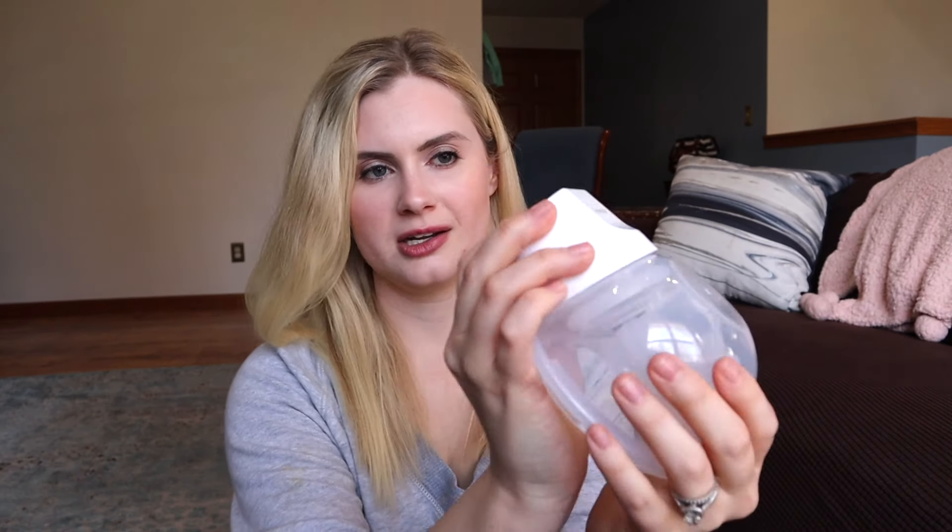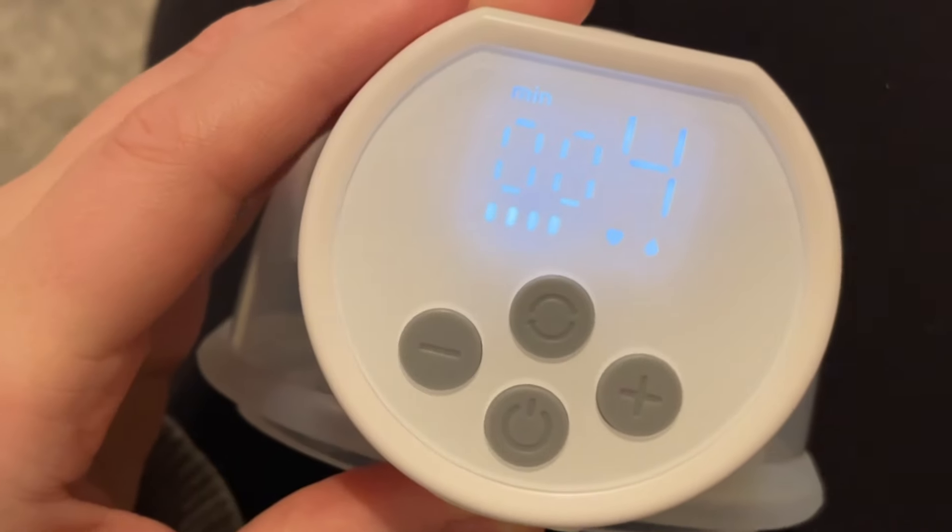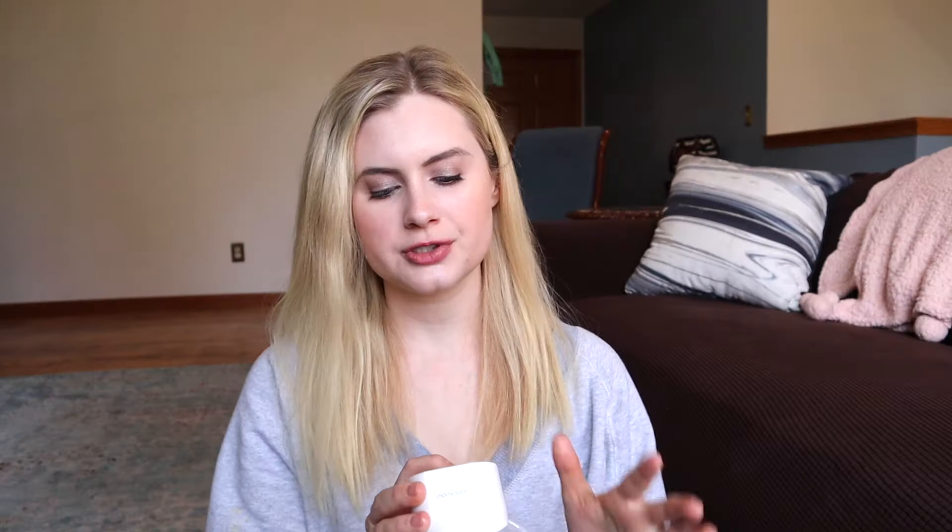Here's how to pump with your Mom Cozy S12 Pros. Hold down the power button with a long press, and it starts in combination mode. I would switch it to massage mode — that's the one with the heart icon. To switch to expression mode, use the top button — that's the teardrop icon. There's also combination mode with short pulls and then a long pull. I personally wasn't into combination mode, so I just did two minutes on massage mode and then switched to expression. I love the digital screen — it tells you how long you've been pumping plus what level and mode you're on.